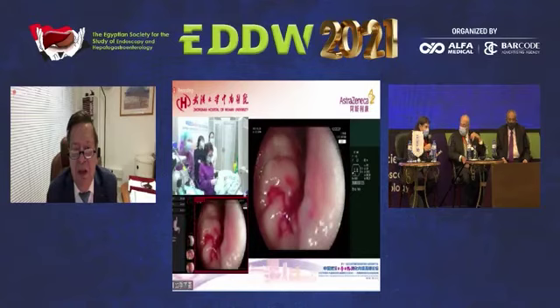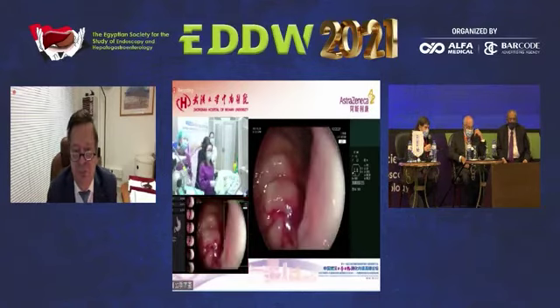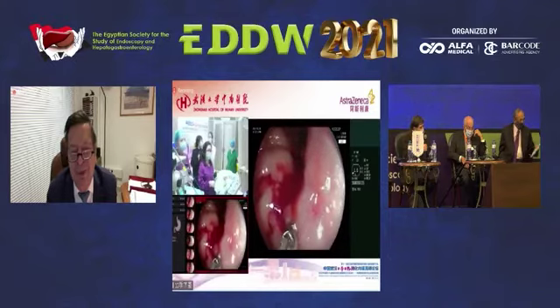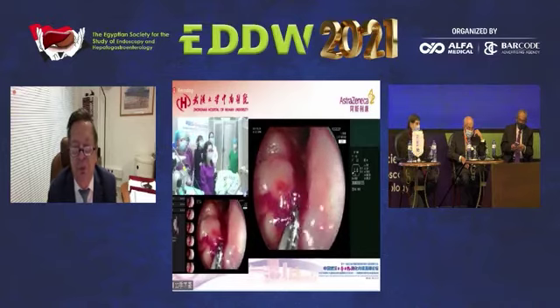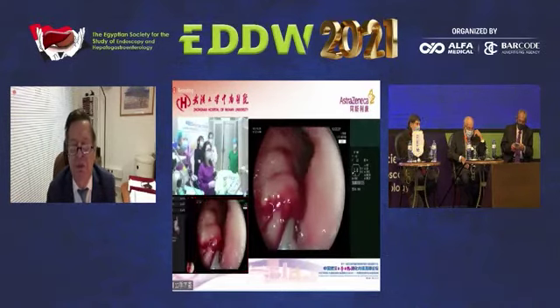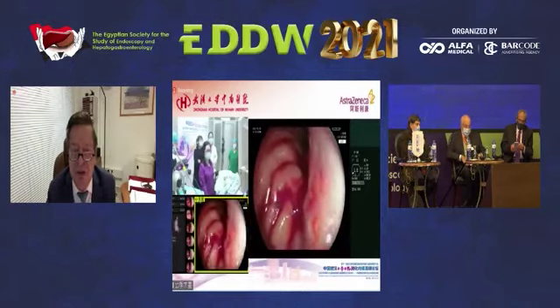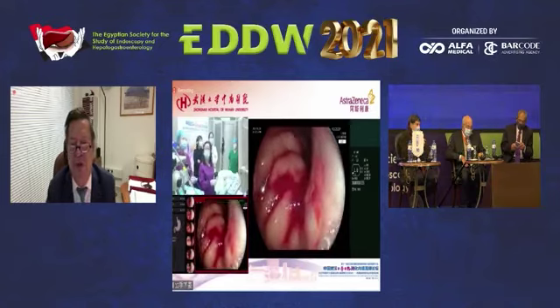Dr. Francois, are the techniques they are using just for detection or for diagnosis? For the time being, I use artificial intelligence only for the colon, because they develop some artificial intelligence for the stomach, but in the West we don't have a lot of early gastric cancer. So the tool that I will talk about later this morning is specific for the colon. I don't use artificial intelligence for the time being on the stomach.